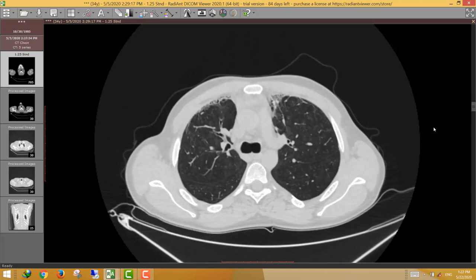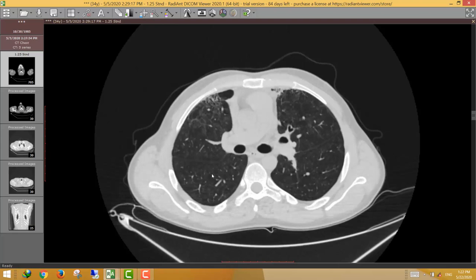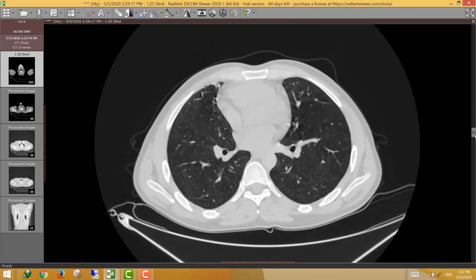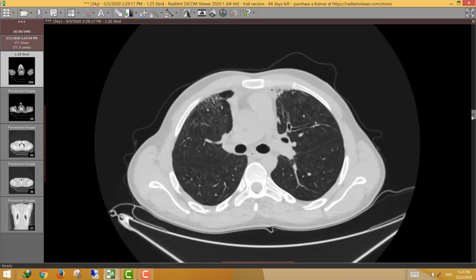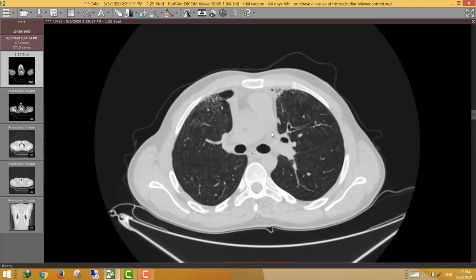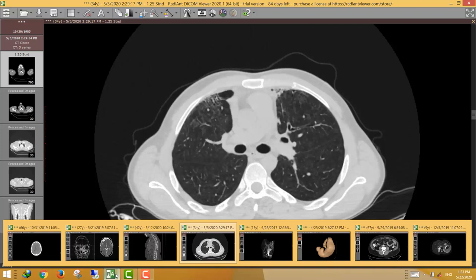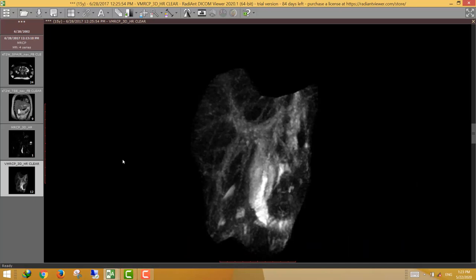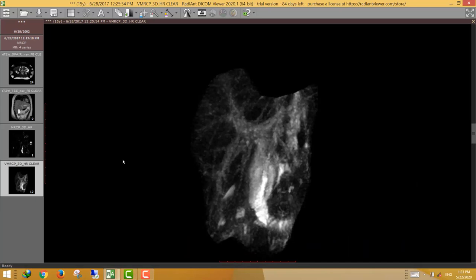The rest of the lung shows nodular ground-glass opacity in the dependent portions, which are residual sequelae from previous pneumonia and lung inflammation. This case is typical for post-ARDS fibrotic changes, especially given the history of ICU admission, for correlation with clinical data and previous unavailable studies.